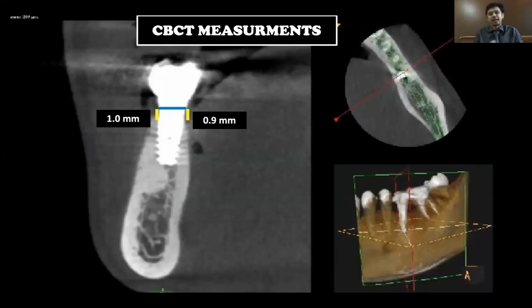And then finally, at the end of 1 year, the amount of bone loss was less in the bisphosphonate treated implant group as compared to the group in which implants were not coated with bisphosphonate. So this is again a chair side thing which you can keep. If you don't feel like taking blood, or you have trouble finding the vein for blood aspiration for platelet concentrates, etc., bisphosphonate can be used. So again, this is one thing which can be used.